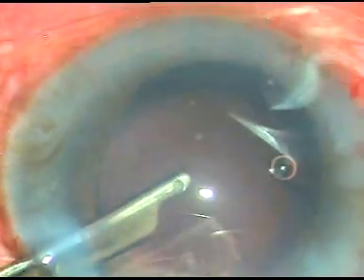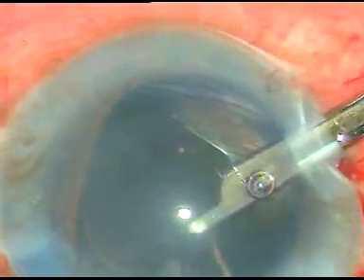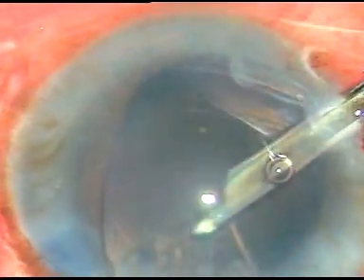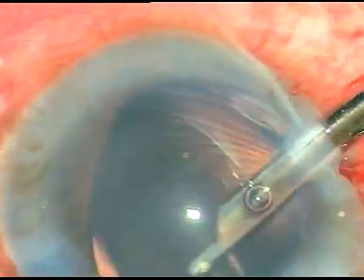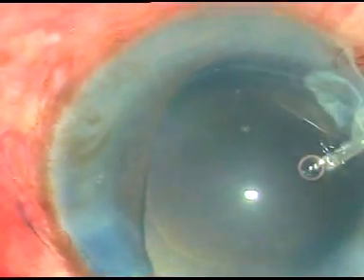Now I go through the other side port, the right side port, to remove the cortical matter from 12 o'clock and 1 o'clock. That's it. The cortical matter is cleaned.